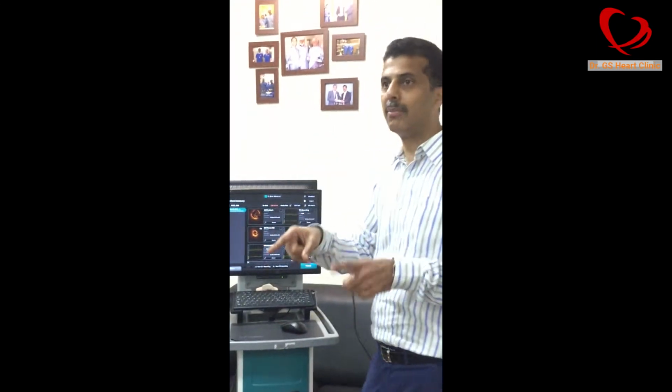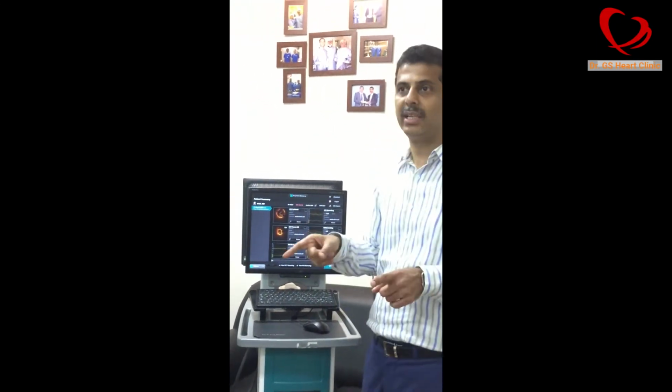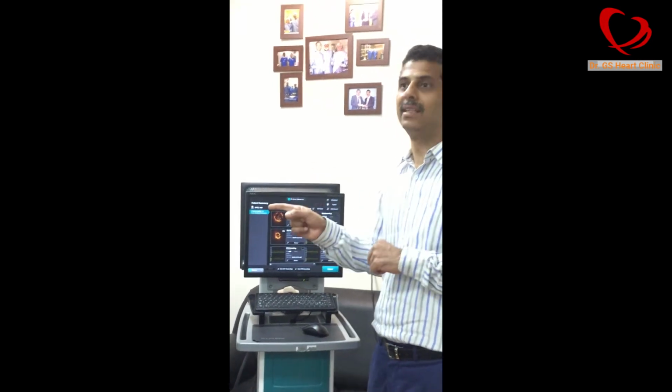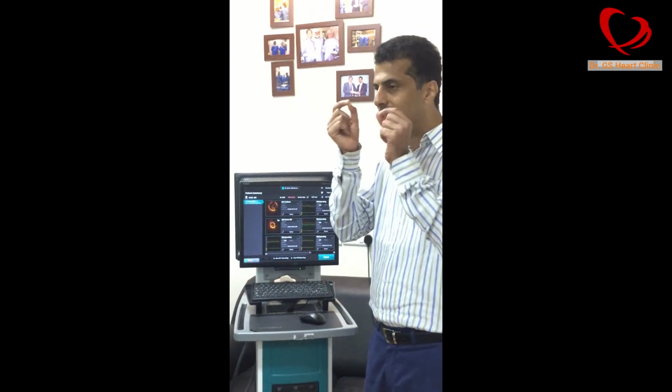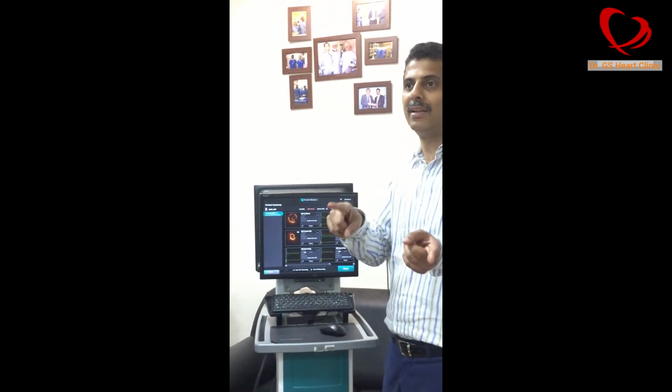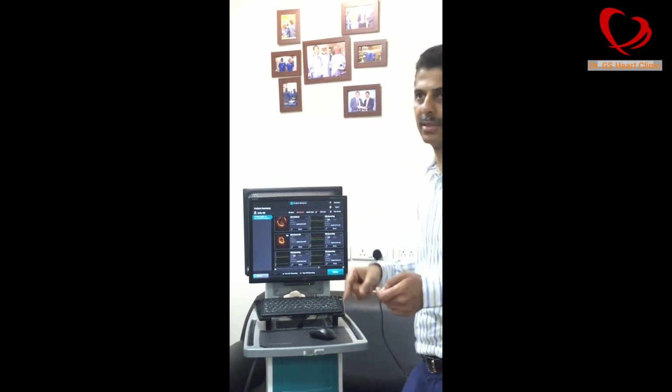Because compared to angiogram alone, if you use OCT to guide stenting, they call it precision PCI, which means you have optimized the stenting result. Because the small things which are not seen in angiogram will be clearly seen in OCT, so that we can correct it if we find any problems there.